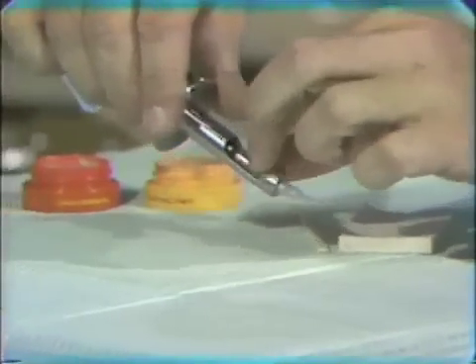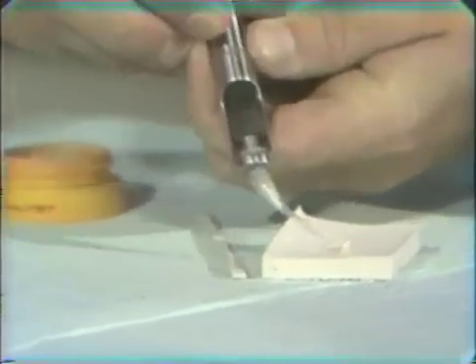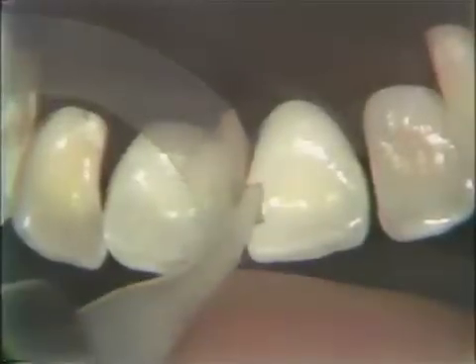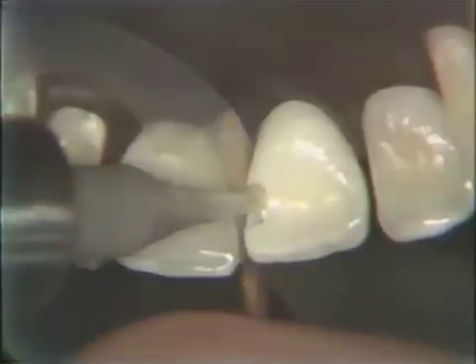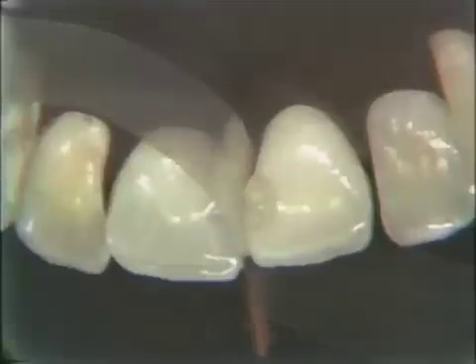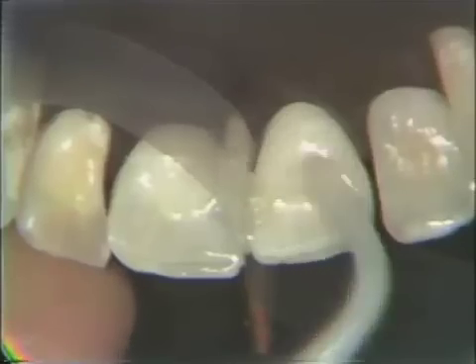Into the syringe, and a little pressure is placed on the handle to squirt out some of the material. There. Do you see the material come out? Now it is placed into the furthest point of the cavity preparation. Very important: keep it in contact with tooth structure, squirting and withdrawing at the same time. You have to overfill, but do not overfill too much.